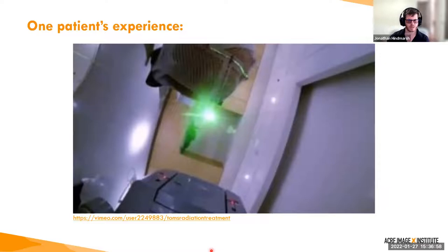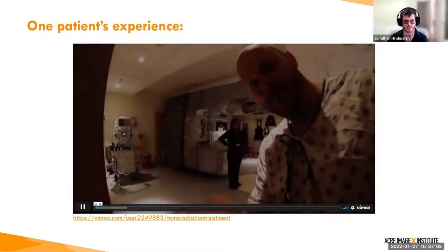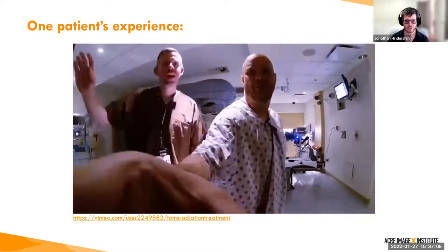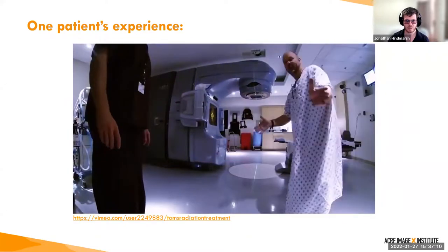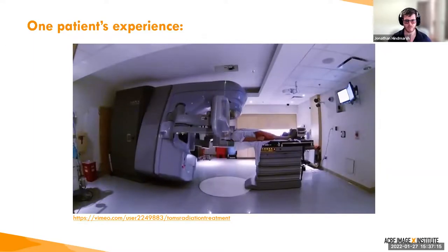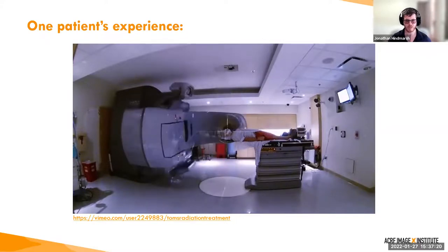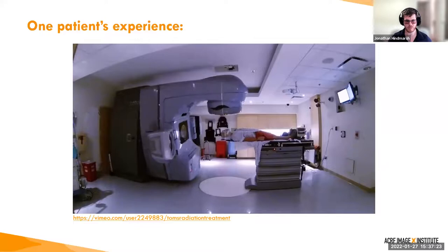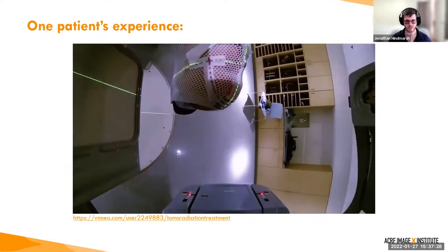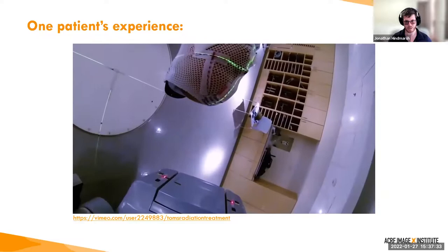So hopefully this video will work. Okay. This is an example of a patient treatment, head and neck. And you can see this guy has been setting up for treatment. This is the imaging component where he's getting scanned with a cone beam CT. He's receiving brain treatment. You can tell that because the lasers are focused on his brain. He's wearing a mask that only goes down to upper neck.